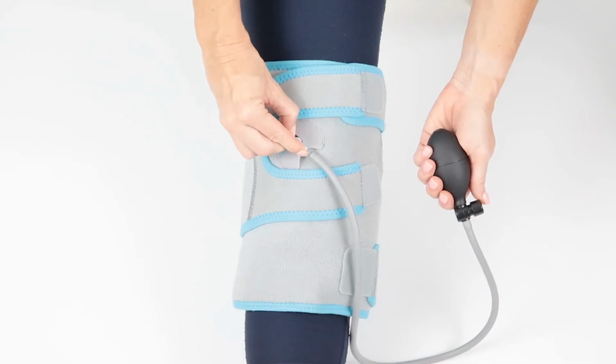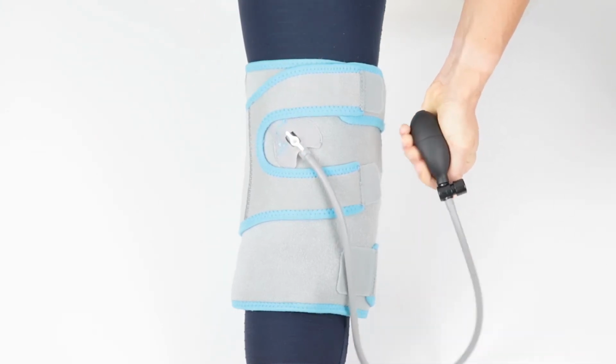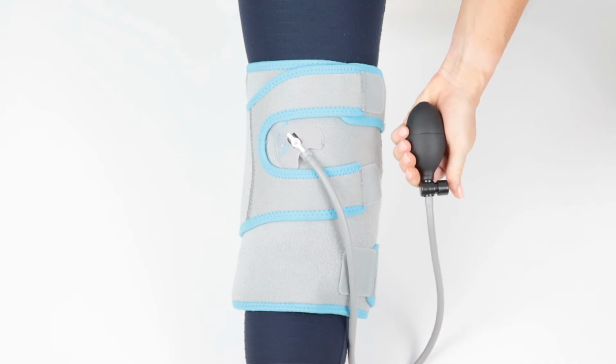Turn the air valve on the brace to open and begin pumping to desired compression with the attached balloon pump. If you overinflate the brace, press the black button beneath the balloon to vent the air.